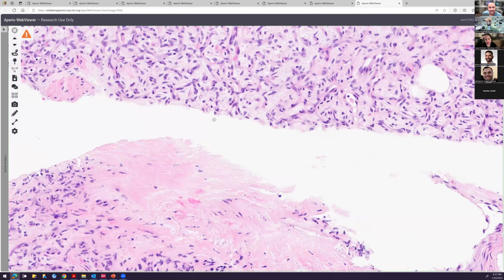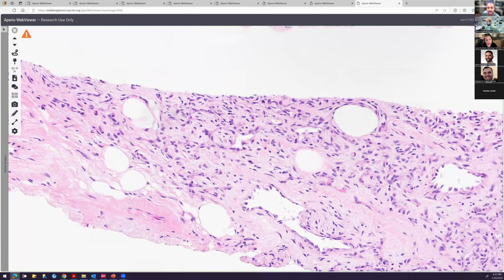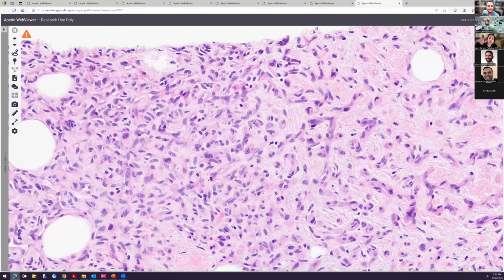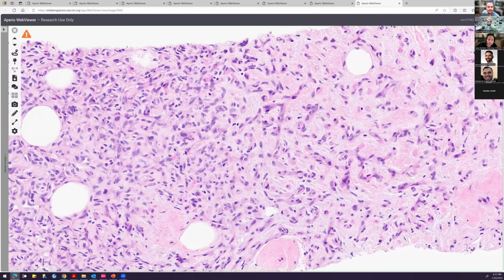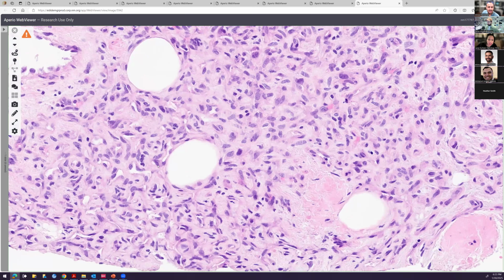It has this fibrous background. Yeah, it's kind of fibrous. There's a couple of bigger cells throughout here, or bigger vessels, but mostly a lot of vascular tissue. I think I'm mixing up the vessel cells with the other cells within the stroma. Can you point out a few of the vessel cells? That's a good point, right? How much of this is endothelial cells and how much is stromal tissue? That's a good question. To be honest, it's all predominantly endothelial cells, right?